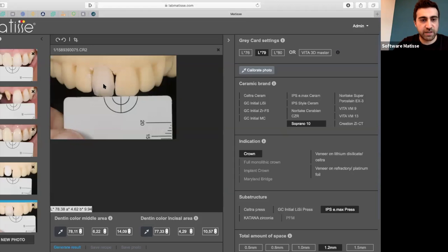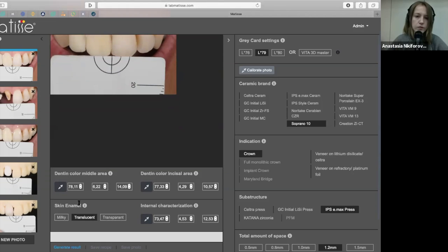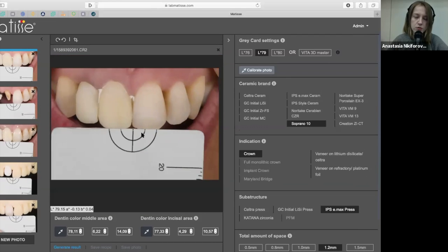You can also do this for a specific area, for example. 77.4 and almost 10. So basically you are trying to have a shade match with numbers. You saw how the system works, and why we are able to give you this. I hope you understand how this system works. This way you achieve the needed result.